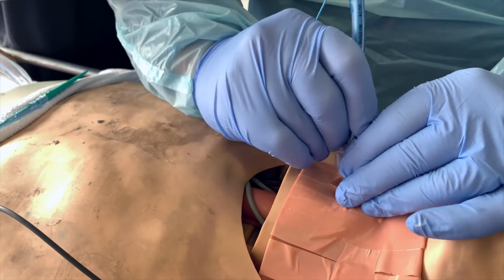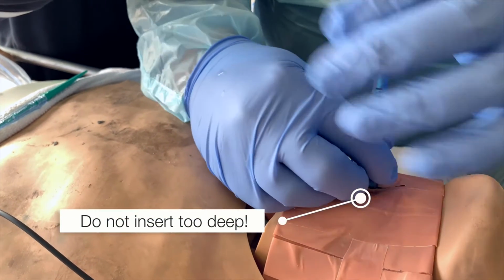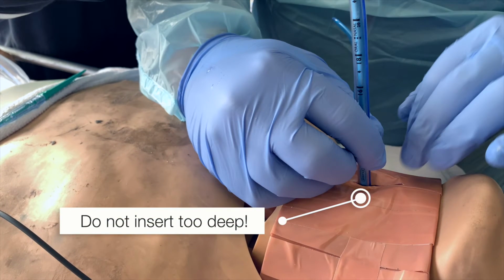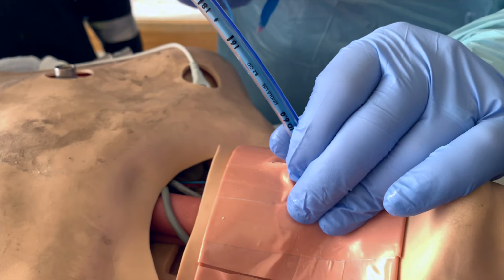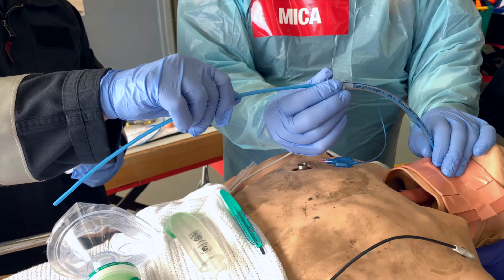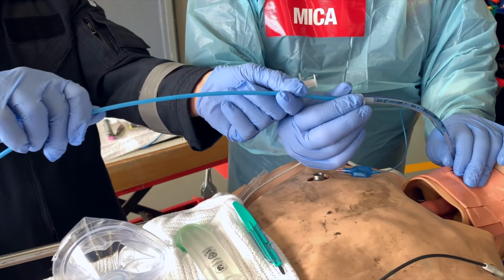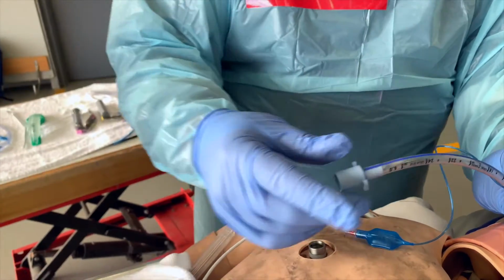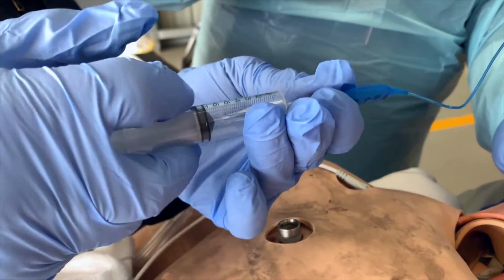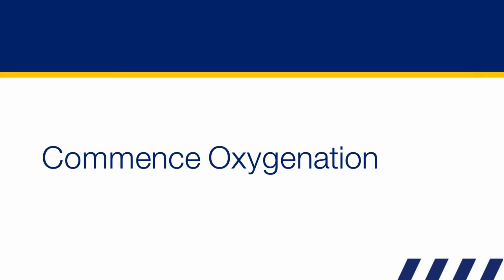Once the ETT passes through the dilated incision, stop insertion when the cuff is no longer visible outside the larynx. Right main bronchus intubation is a common consequence of this procedure, so ensure correct positioning. The lead clinician then grips the ETT at the insertion point to ensure the correct position is maintained, and the assistant removes the bougie. Avoid flicking body fluid from the bougie by ensuring the assistant grasps the base of the bougie as it exits the ETT. Inflate the cuff with a 10 ml syringe or manometer.